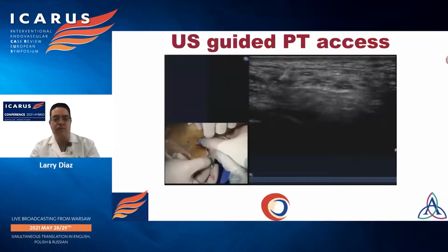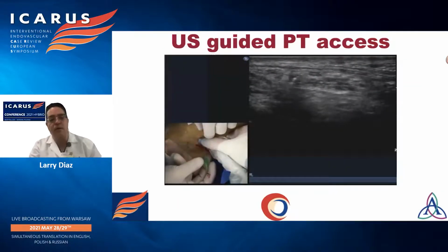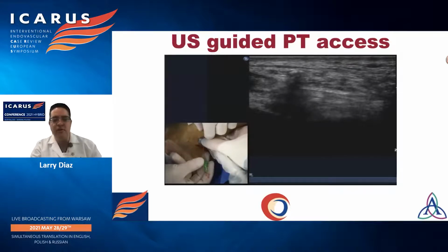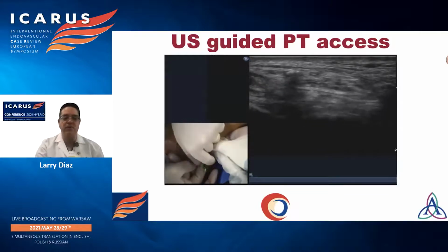So we perform here retrograde ultrasound-guided access of the posterior tibialis. We start in the transverse view. As you can see, the needle is bouncing from the wall of the PT, which is heavily calcified. So we continue to what I call dance with it until we get in.